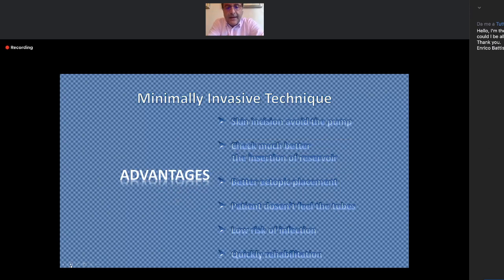I had about 100 penoscrotal approaches before switching my technique completely. I went to Miami to attend Paul Perito's course, and when I saw the technique, I was very fascinated by it. Why did I decide to switch the technique? There are a lot of advantages.